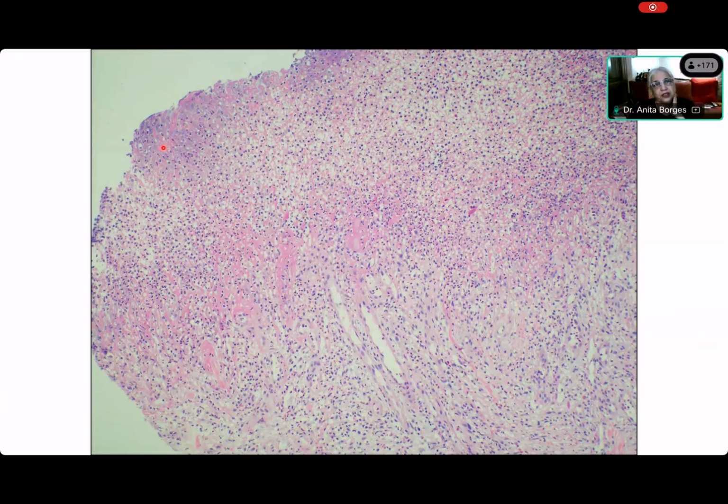Okay, so here you have the floor, which has been digested by the enzymes in saliva. Here is your fibrinous exudate. Here are your leaky blood vessels. Okay, here is a much more mature capillary network that is there. And now, for the first time, you are beginning to see the base of the ulcer. Okay, so let's start from the top.